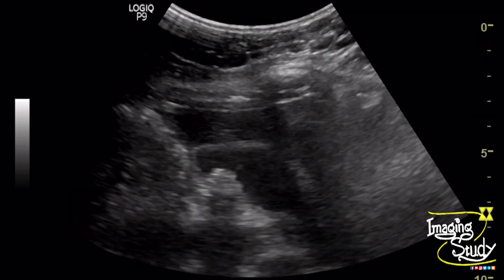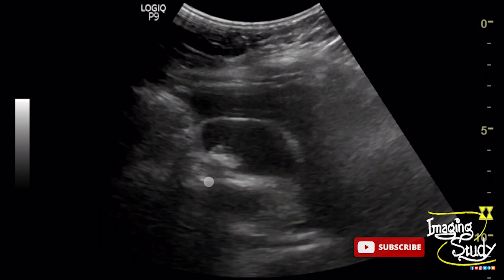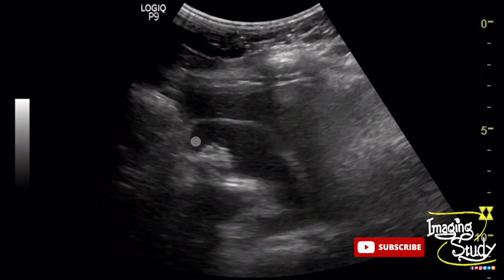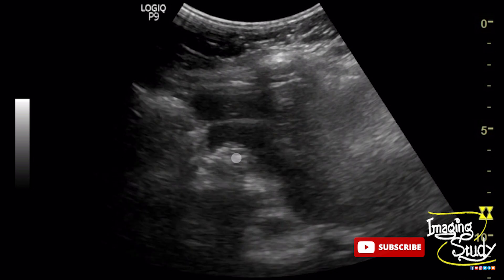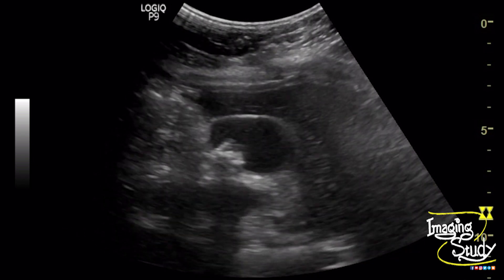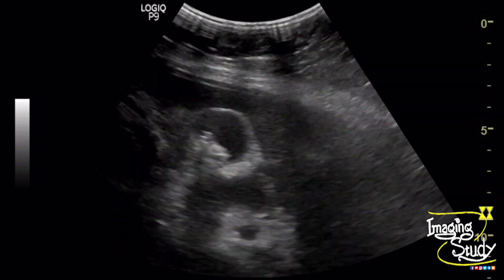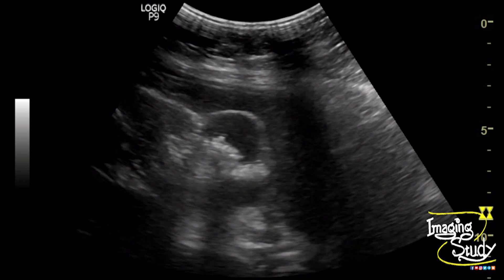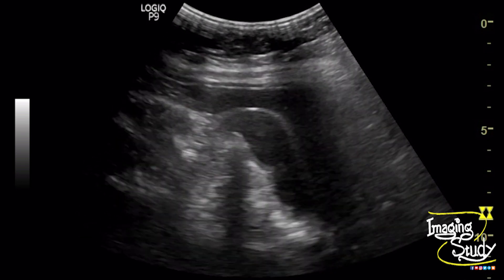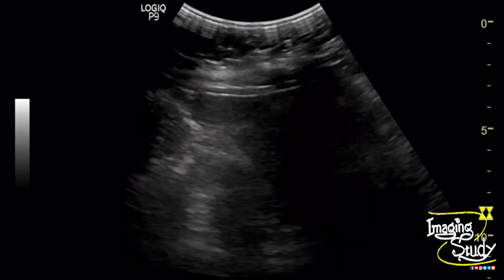Magnifying the image, you can see the stone shows an irregular surface which was not well visualized previously. Magnifying the image will give you a very good idea about the stone shape. This will also help you exclude any other lesions like polyp or mass adjacent to this lesion.